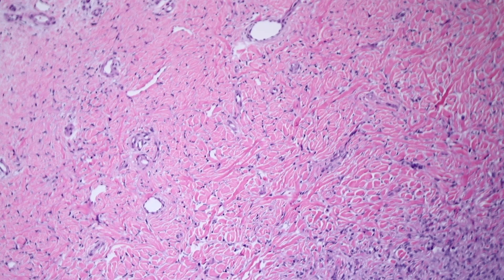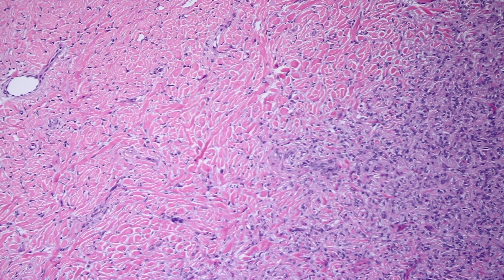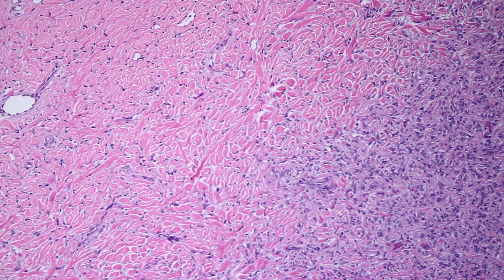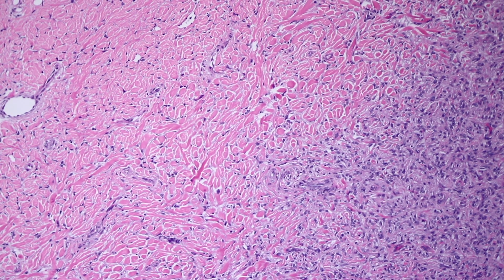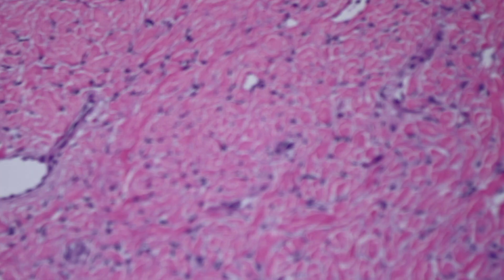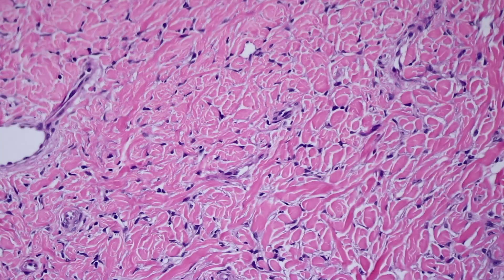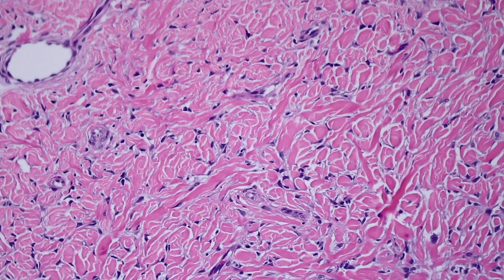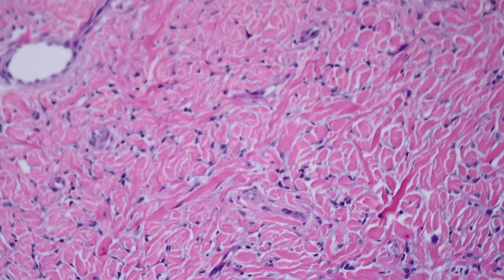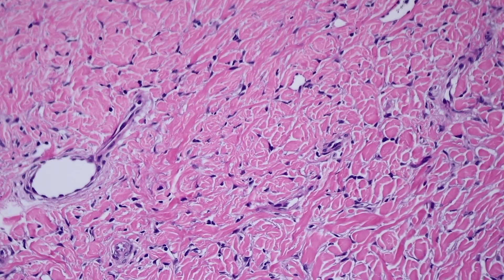Look over here - a beautiful example of the entrapped collagen pattern that we see. You can see more cellular areas of the tumor to the right, and then at the periphery it fades out and trickles into what looks more like the atrophic form of Dermatofibroma, where you have these dense collagen bundles and individual little triangle-shaped or boomerang-shaped cells that are trying to wrap around each little collagen bundle, getting wrapped and trapped by the tumor cells.